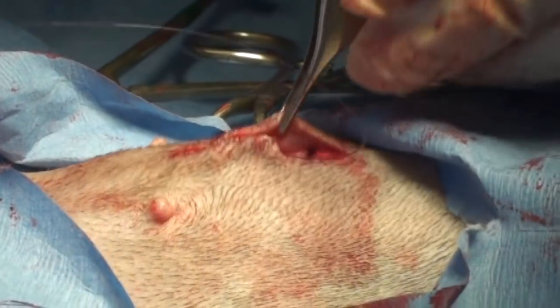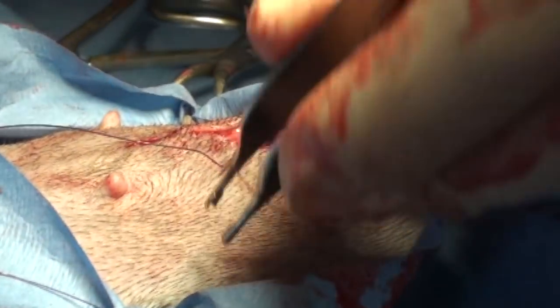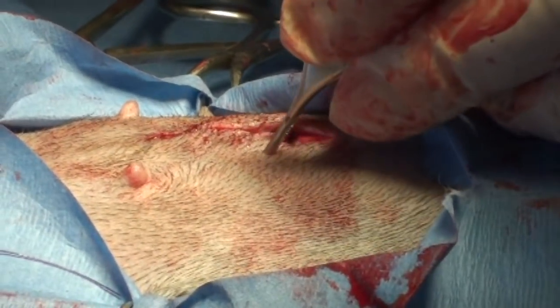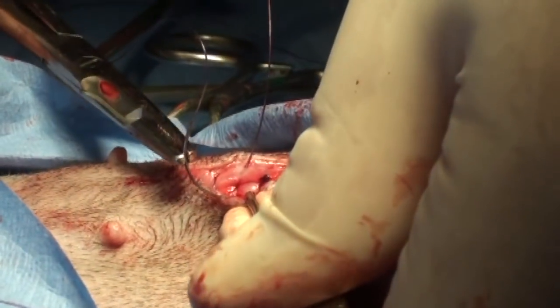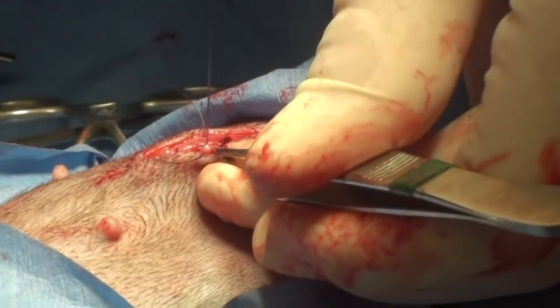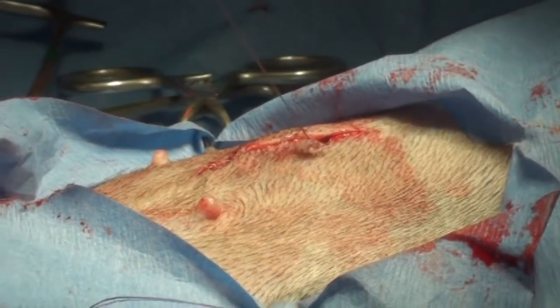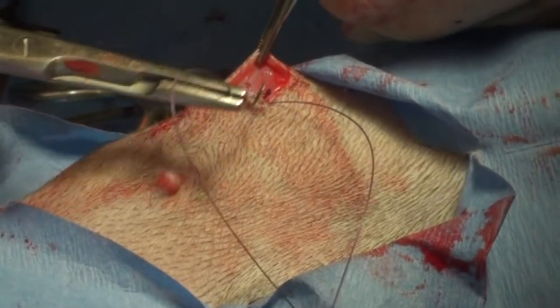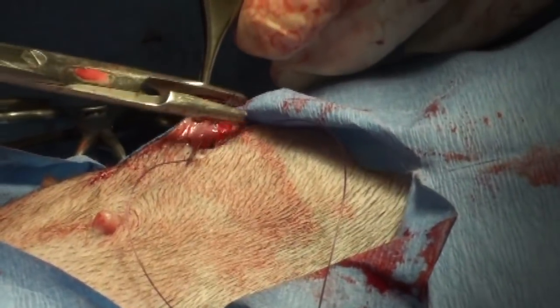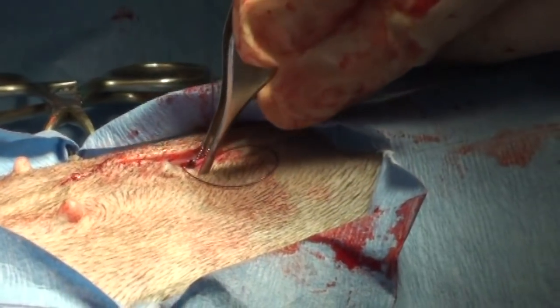I might put a few skin sutures just to show you the difference. But normally I would just put a little tissue glue. See how that's going up one side and then pull it out with the tweezers, going down — see how that just closes it up so nice and pretty. This is the last one, so I'm going to put it a little deeper because we don't want the knot sticking out. It goes deep like that and then through the other side again, same thing.